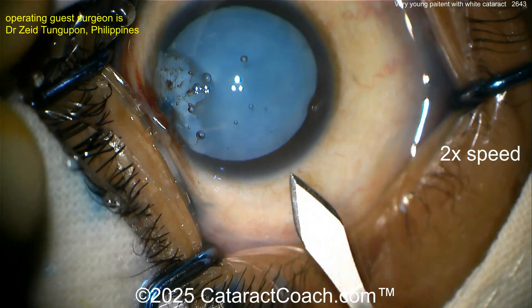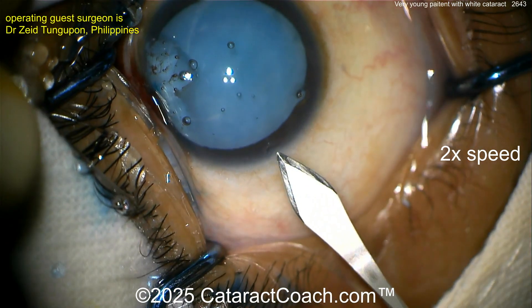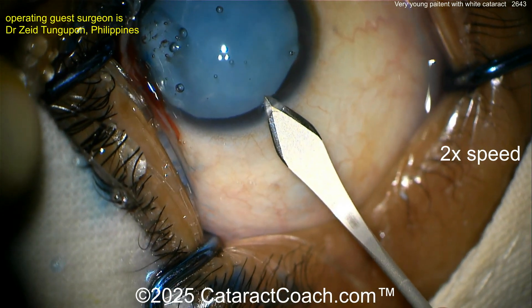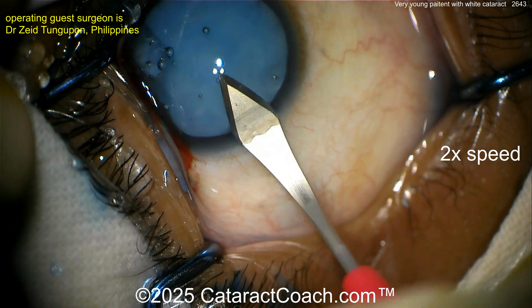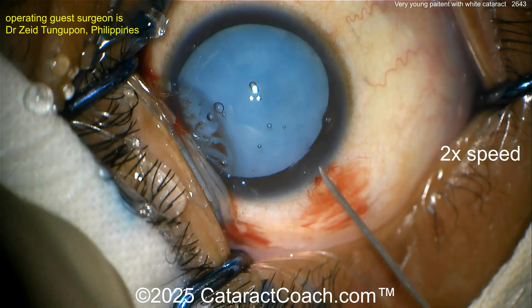Now let's see the main incision going in here. Fixating the eye with a cotton swab — I like that you pull the incision back a little bit. That looks reasonable. And what are we going to do to decompress this?